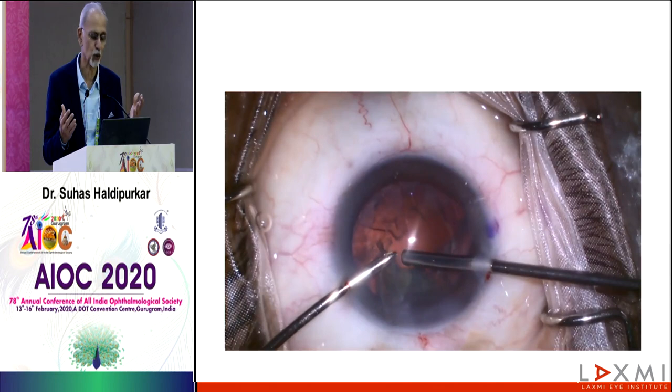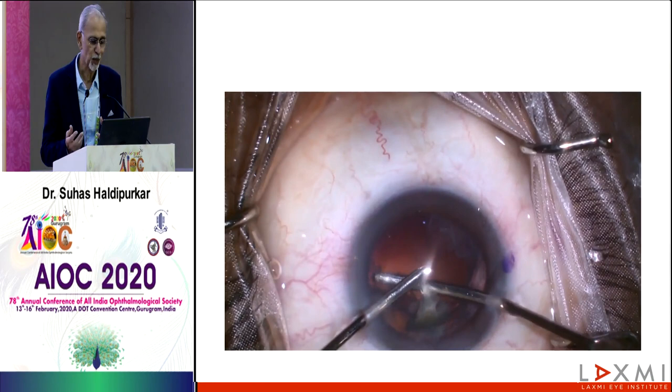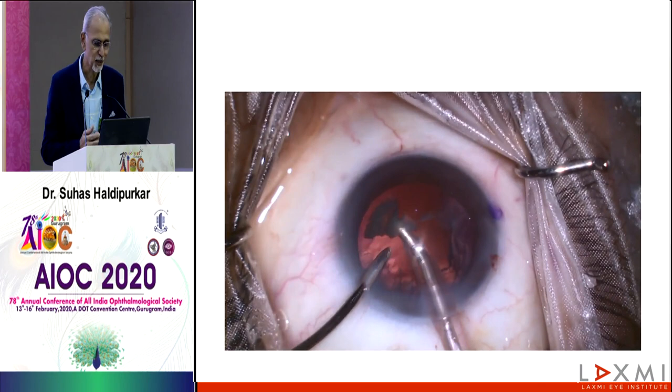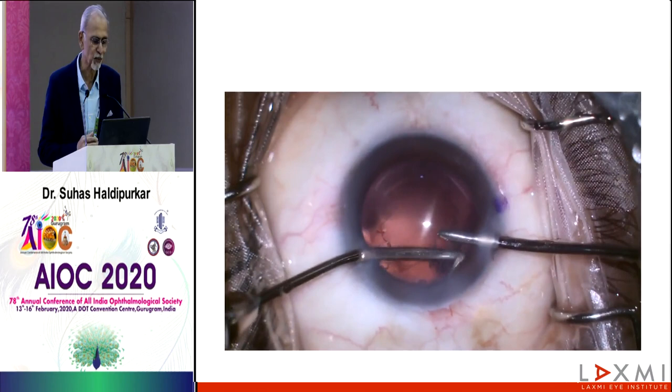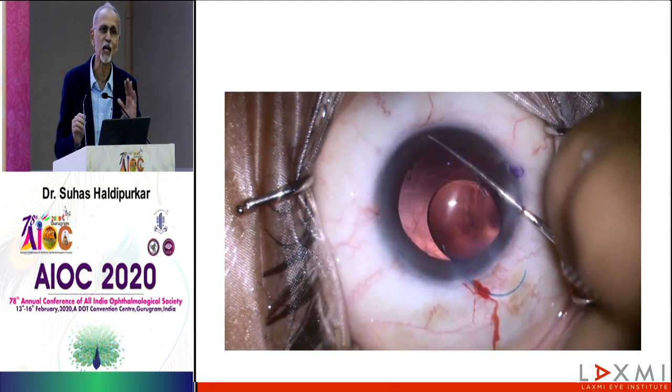And then what best can you do? You can only clean up whatever you can, and clean up you must. I know by now, I'm not like many of these who are also VR trained, but I have the benefit of a VR surgeon operating in the next theater. So I just go ahead very meticulously without any expressions, because the patient's eyes are open, everything else is closed. He's listening to everything that you talk or you express.